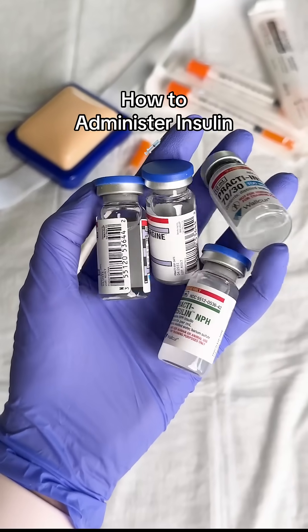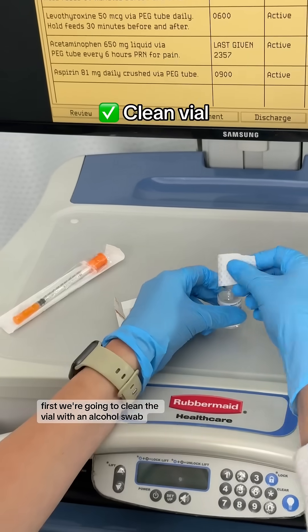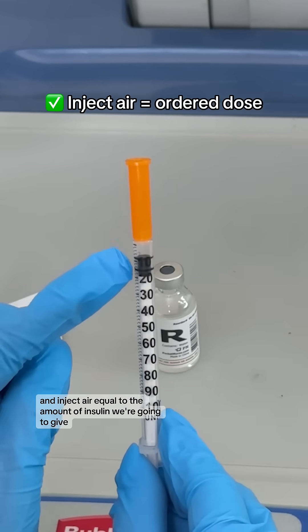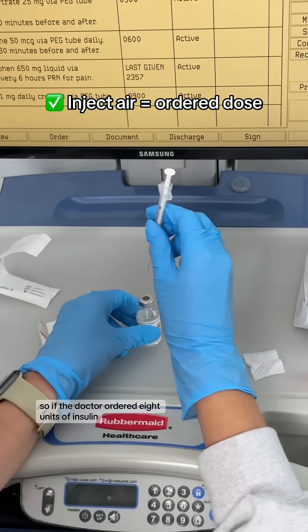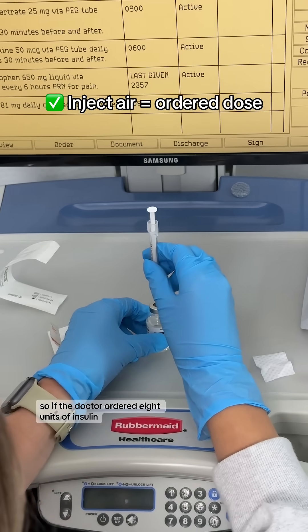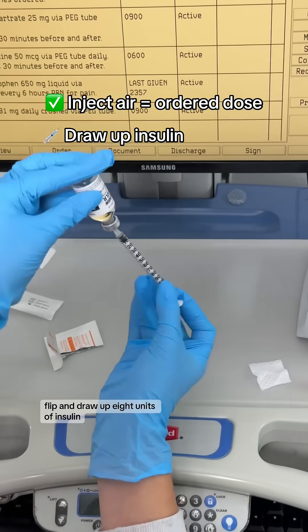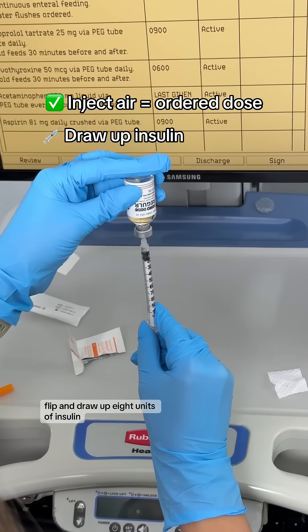Let's talk about how to administer insulin. First, we're going to clean the vial with an alcohol swab and inject air equal to the amount of insulin we're going to give. So if the doctor ordered eight units of insulin, we will inject eight units of air into the vial, flip, and draw up eight units of insulin.